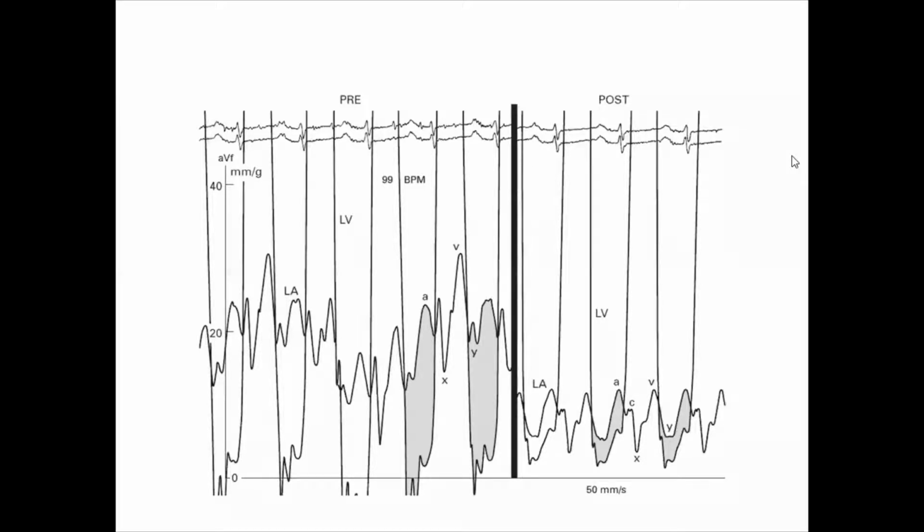Okay. This is simultaneous hemodynamic tracing. Good. In a scale between the LV and LA. This is the LV and LA in a scale of 0 to 40 plus. Okay. We have pre and post. Yeah, it seems pre and post procedures. Okay. Yes. So we have here.